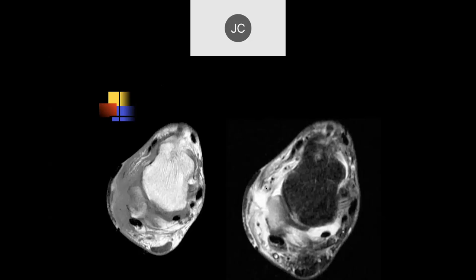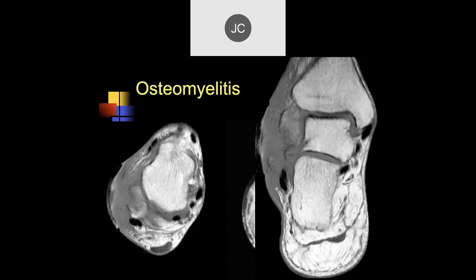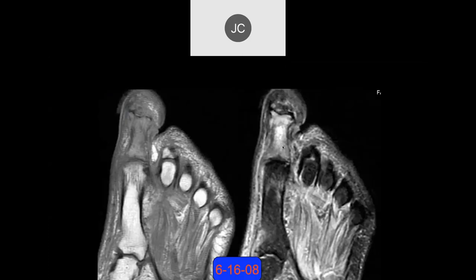Looking at the lateral ankle, I see fluid in the soft tissues and an erosion in the lateral malleolus. Similarly, I'd be concerned for osteomyelitis. On the coronal images, we can see all this soft tissue edema and thickening, marks of cutaneous thickening, erosive change, and edema within the lateral malleolus. This was osteomyelitis with a lot of associated cellulitis.